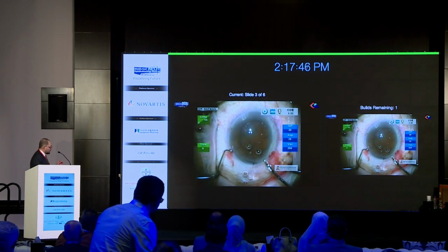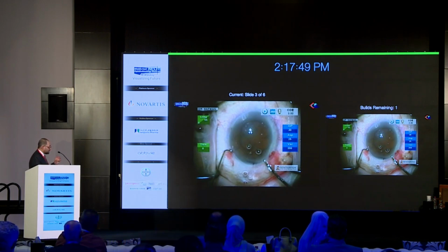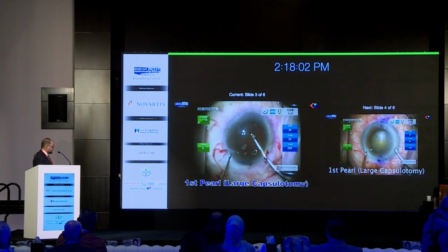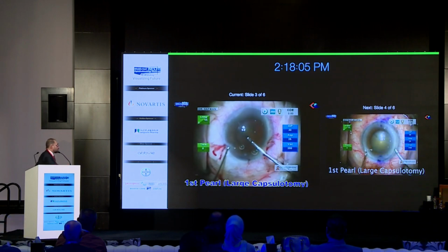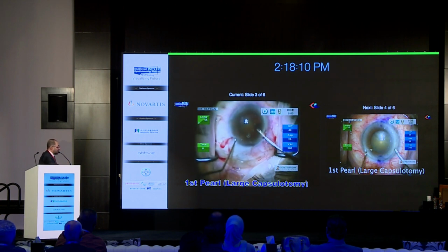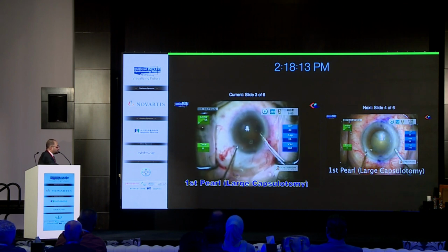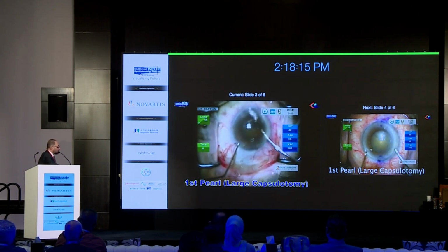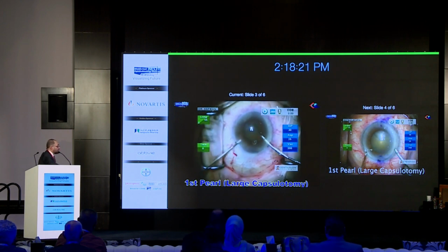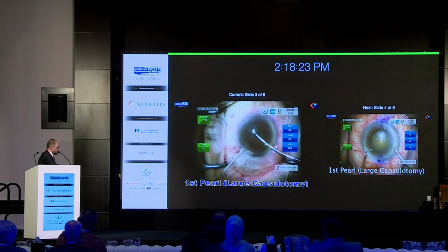Now this video is a little bit accelerated, but it will show you all these steps, and the steps will appear at the bottom. Play, yeah, I'm playing. Now the capsulorhexis: you can see that I have digital marking, but I didn't use it because I need to use the largest possible, as most of those patients have a small pupil, but here I was not in need to enlarge more than that. I was on the margin under the pupil capsulorhexis.